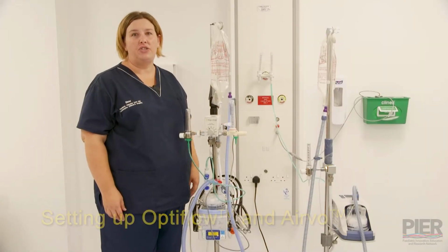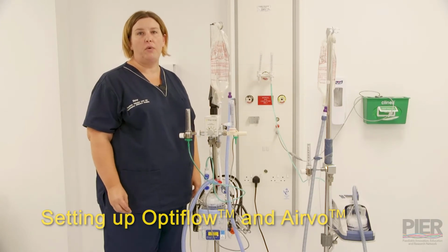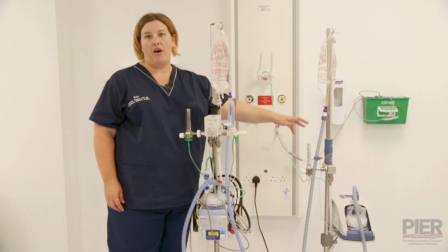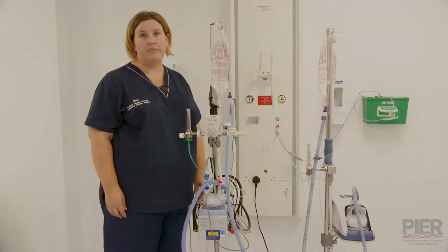So this video is going to introduce you to Optiflow and Airvo. Both provide humidified high flow oxygen. The biggest difference being that Optiflow requires piped air, whereas Airvo will entrain air from the environment. So it's easier for use on the wards that don't have piped air as an option.